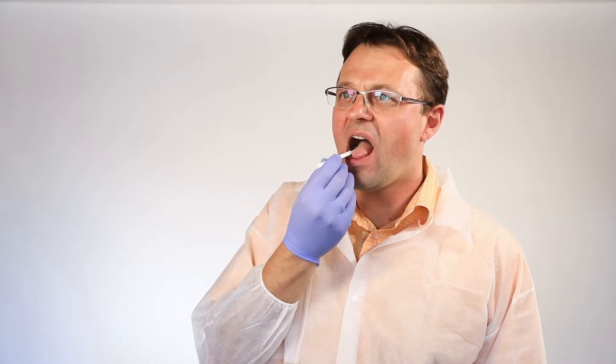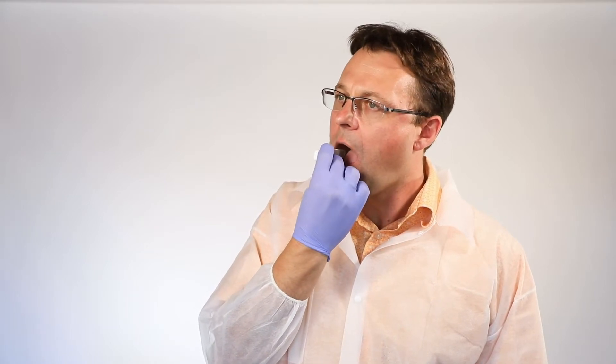To properly stimulate and collect saliva, wipe the device along the top sides of the tongue, below the sides of the tongue, and inside the cheek. Then place the device underneath the sides of the tongue as if you were taking the subject's temperature with a thermometer.